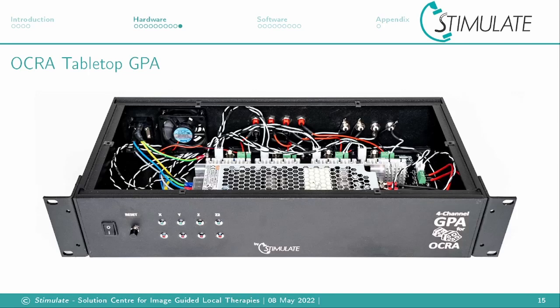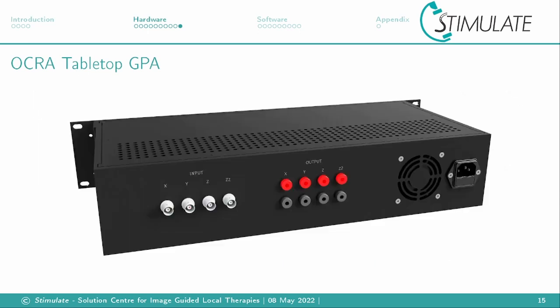On the inside you can see the big power supplies and the amplifier printed circuit board, but also a fan for cooling. The power supplies have ±15 volts. On the back of the gradient amplifier you see the input and output connections. The input can directly connect to the OCRA console and handles ±10 volts. This gets amplified to ±10 amperes on the output.